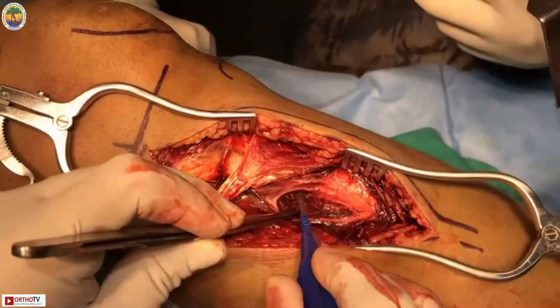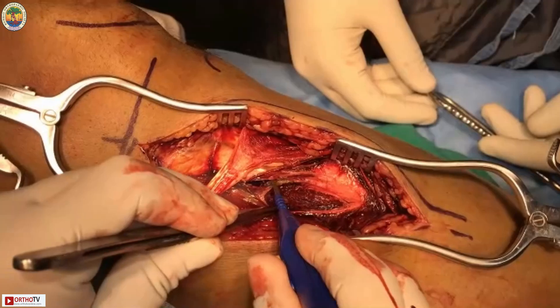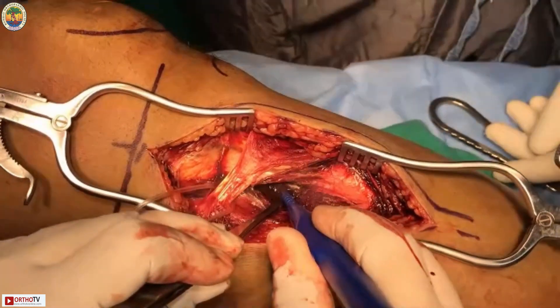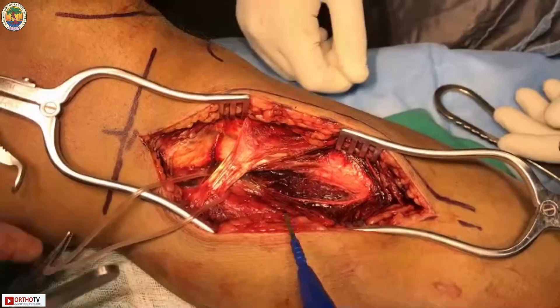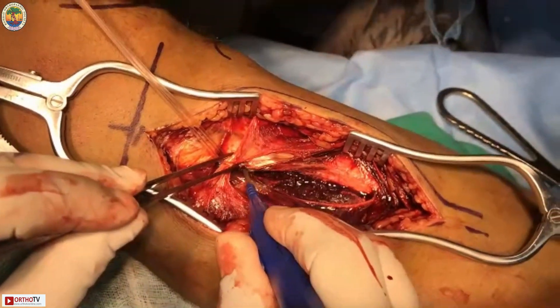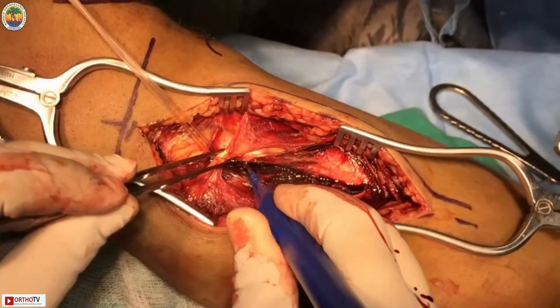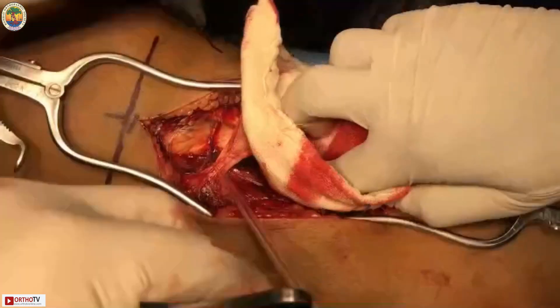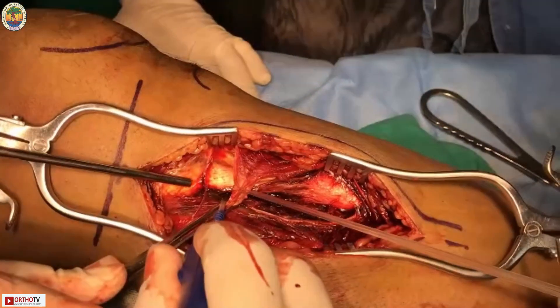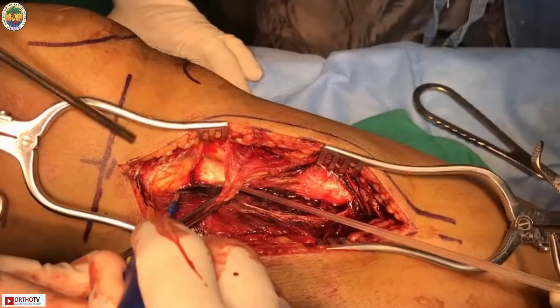The semimembranosus is attached to the posterior medial border of the upper end of the tibia. A plane is made between the MCL and the junction of the semimembranosus and MCL is cut going exactly over the posterior medial border. This is a tricky area and the fascia typically comes at the level of the fracture.